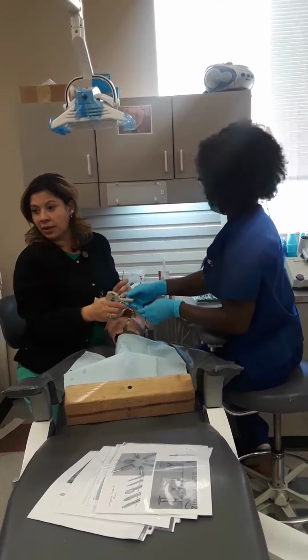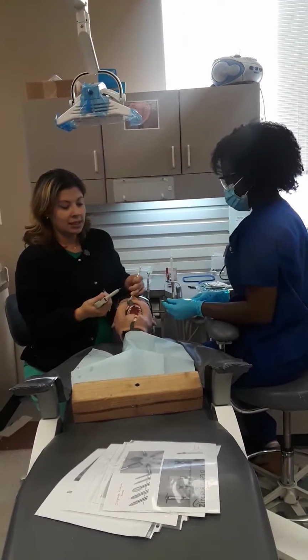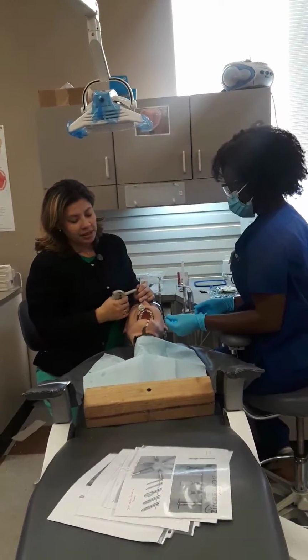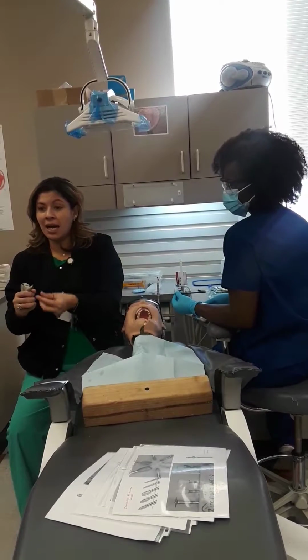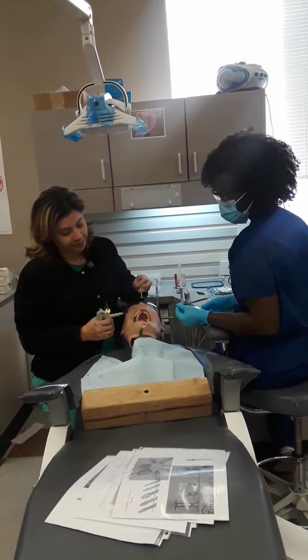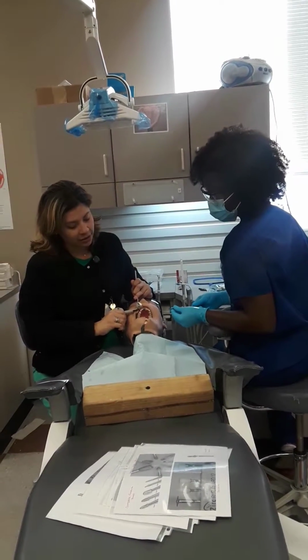Okay, so we were on the bonding stage. She cured for 10 seconds. She passed me my composite. Just as a tip, always pass the composite tip either up or down, whatever. Help the doctor out just a little bit, and then he'll go straight to the tooth. I'm going to squeeze it in there.